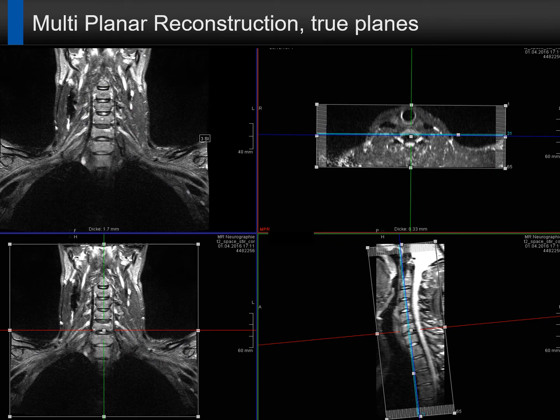However, for me, in the clinical routine, it's much more important that you really get good anatomic images, such as this one. We use 3D reformats, either online or offline, to really get the best out of these sequences, and to have all nerves viewed in different planes.